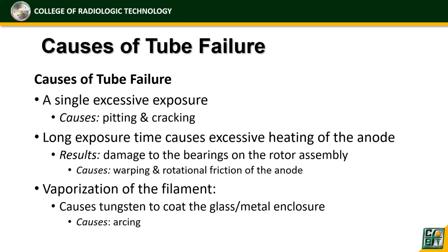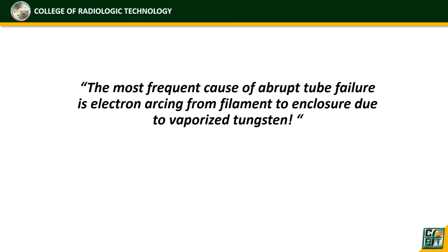Kaya minsan maririnig natin, pagpapahingain lang po natin ang makina. Maaaring sobrang dami na X-ray procedure na naganap within a particular hour. Kaya kailangan pagpahingahin ang X-ray tube. So the most frequent cause of abrupt tube failure is electron arcing from the filament to enclosure due to vaporized tungsten or filament.